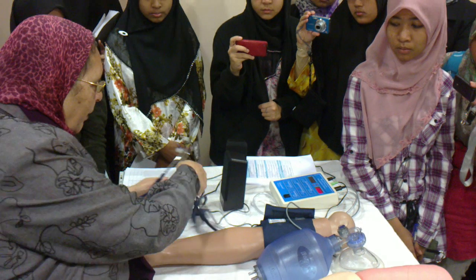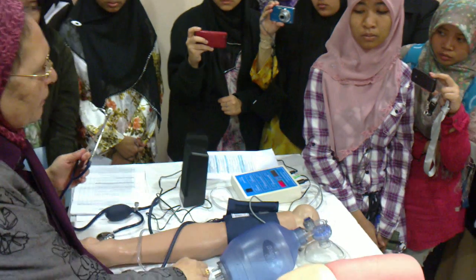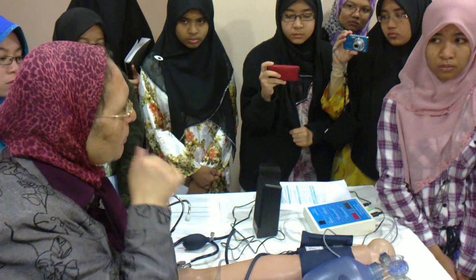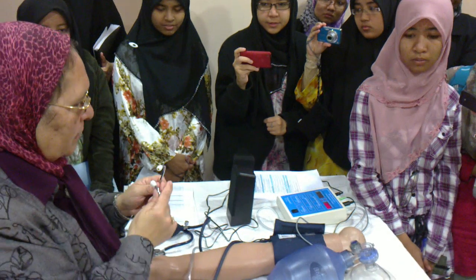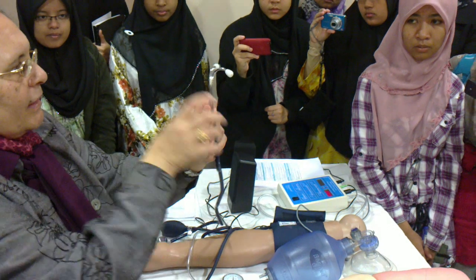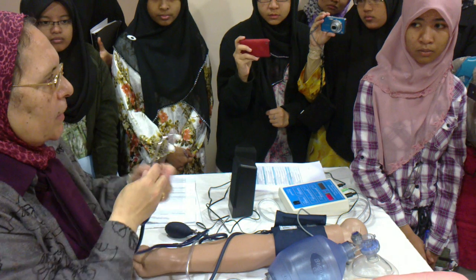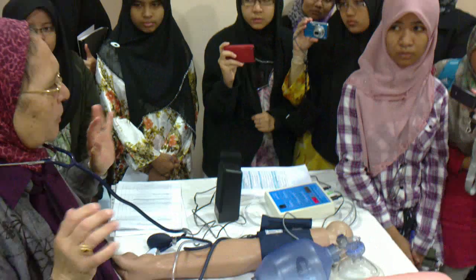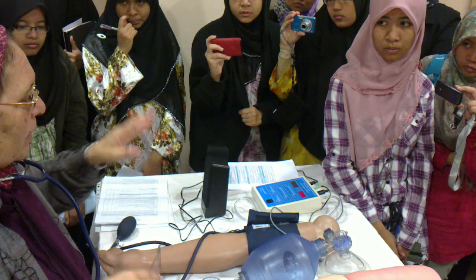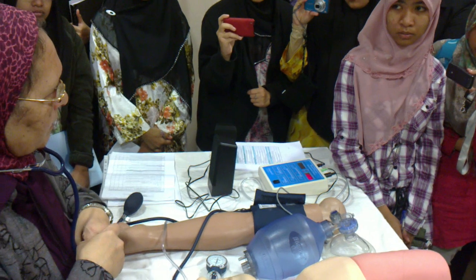First of all, you have to start. Please, if you have a stethoscope, bring it with you. If you haven't, please bring with you an alcohol swab to disinfect it before you put it in your ears. Okay. The stethoscope, you put it like this, so as the direction is forward, so as to be in line with the external auditory canal. First, I will put it like this before putting it in my ear, so as to save time. I'm not letting the cuff inflated around the arm of the patient and causing him harm and discomfort.